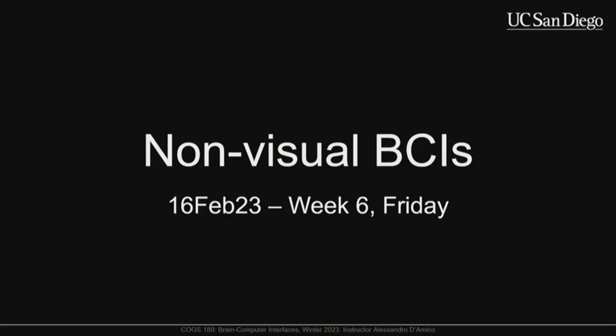So today I'm going to talk about non-visual BCIs. I only realized afterwards that this isn't a particularly useful name, because we've talked about non-visual BCIs, like motor imagery-based BCIs. So really this is talking about BCIs that don't use a visual stimulus as their primary category, but also require some probing from a stimulus as sort of the control signal. So this would be some external, exogenous-based BCI.